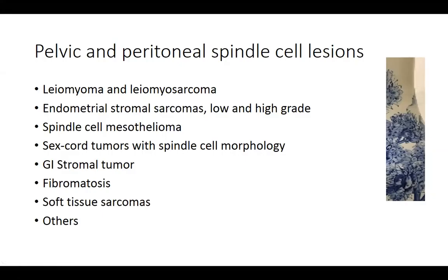So what should we be thinking about with this sort of morphology? We can think about pelvic and peritoneal spindle cell lesions. From a gynecologic pathology standpoint, we might consider conventional things like leiomyomas or leiomyosarcomas, but this lesion doesn't seem to have those features — it doesn't have the fascicular type of growth we'd expect. We might think about endometrial stromal sarcomas, both low and high grade. It's fairly low grade in terms of pleomorphism, but it doesn't have quite the vascular pattern, and the inflammation would be unusual for a low-grade endometrial stromal sarcoma.